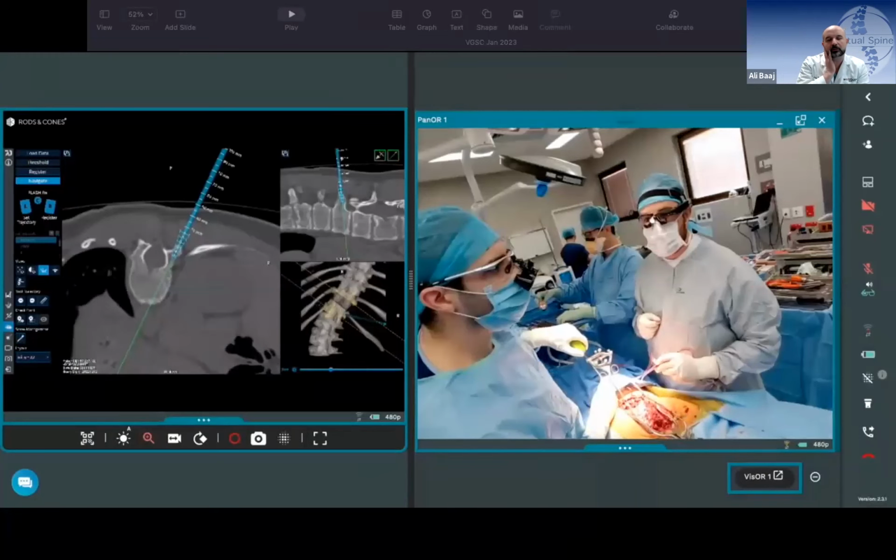And Mike, this is just a little plug for something you were talking about before, which is, you showed the MRI of your wrist. And I'm glad you said that was a wrist, because I was looking for the pedicle and I couldn't find it. So thank you for telling us neurosurgeons that was a wrist MRI. But for ergonomics, and I think you know this because we've interfaced a lot recently, I really like the power tools, the power drill, power tap, power screw. That really helps with that rotation and the stress on the different joints. I imagine this technology is compatible with the automated and powered instrumentation, powered drivers.